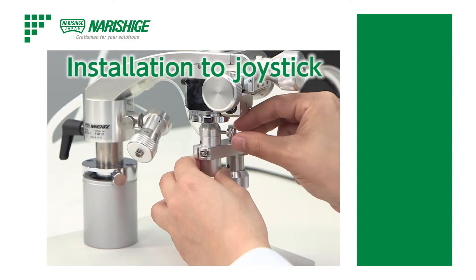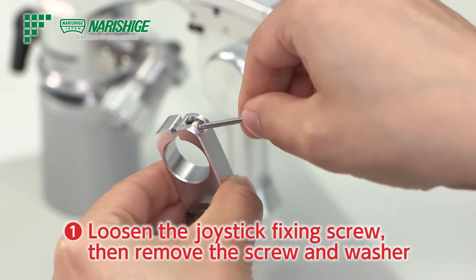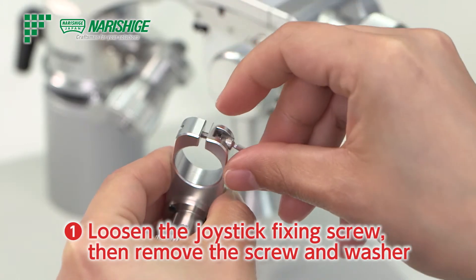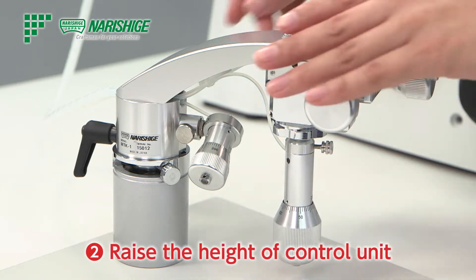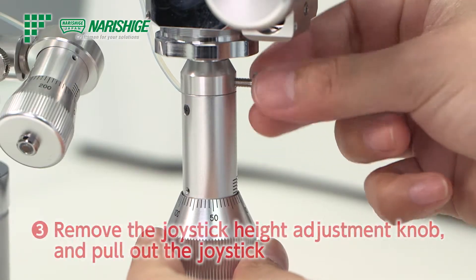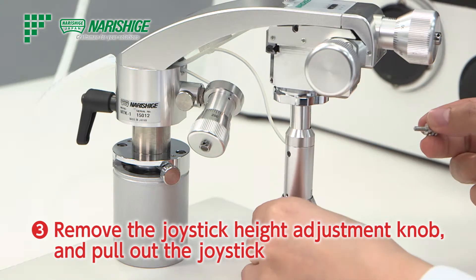To attach the IM HD1T to the Takanome manipulator system, first loosen the joystick fixing screw and remove it along with the washer. Be careful not to lose the screw and washer. Raise the control unit. Remove the joystick height adjustment knob, then take off the joystick by pulling it downward.